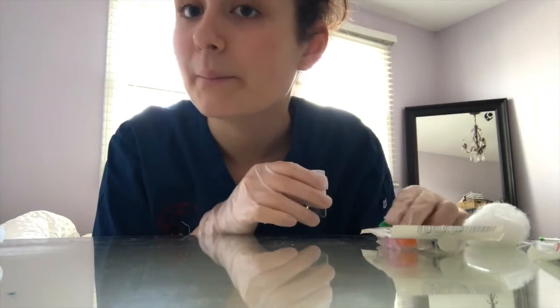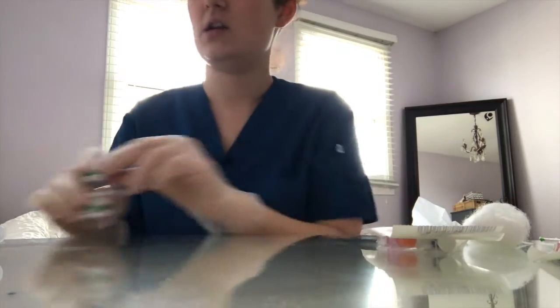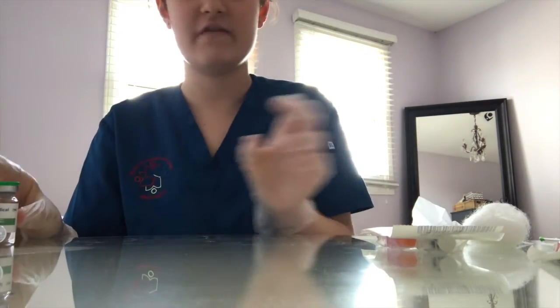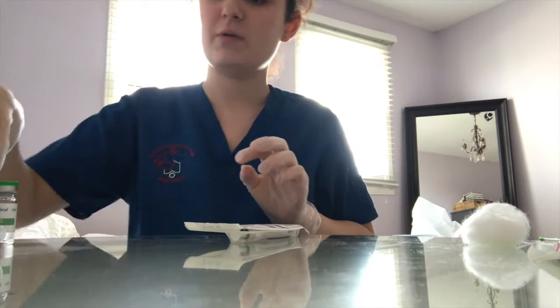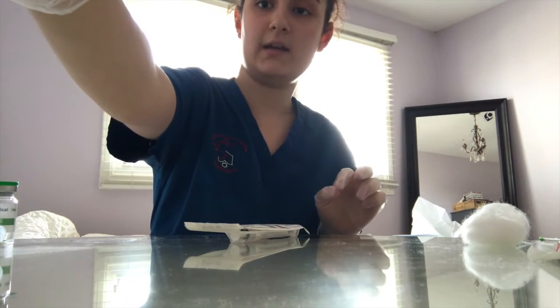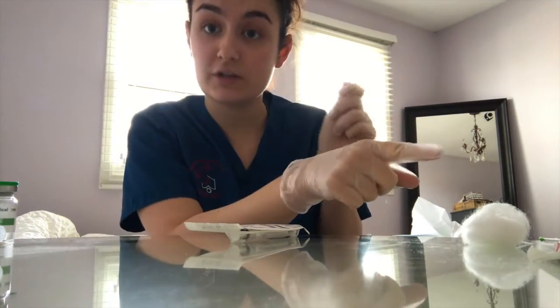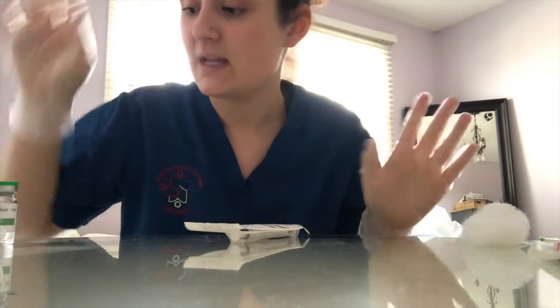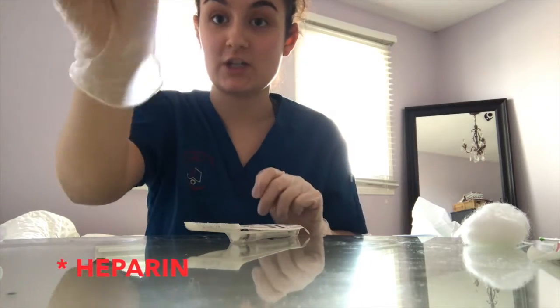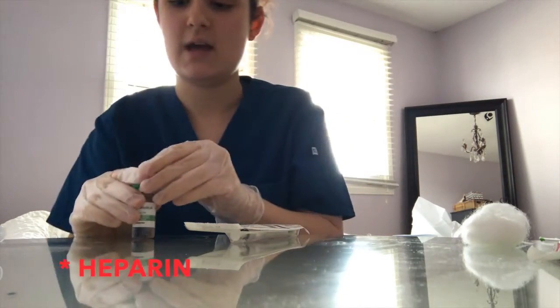Now we're moving to subcutaneous. Again, what's our order? 5,000 units of heparin. So we're going to check the vial. You're supposed to open an ampule, but I'm afraid of breaking glass, so I'm not going to do that. But if you're using an ampule, you have to use a filter needle so you don't inject your patient with glass shards. Let's say that this is now heparin, and we're checking for expiration, hasn't expired, we're good to go. Again, same steps.